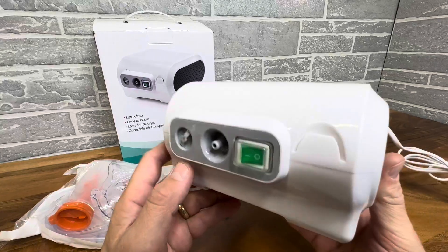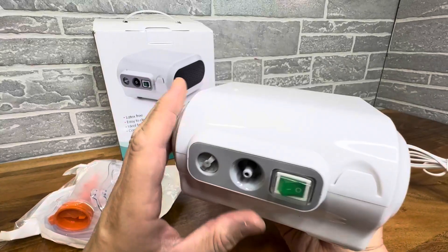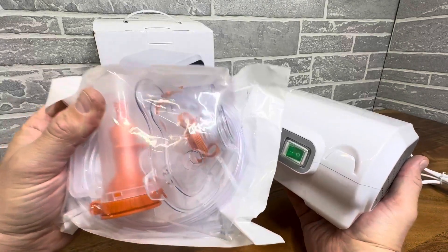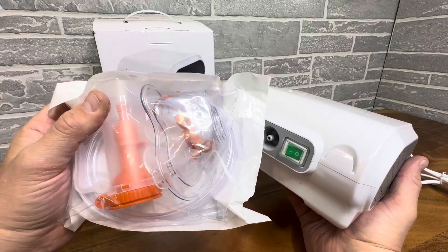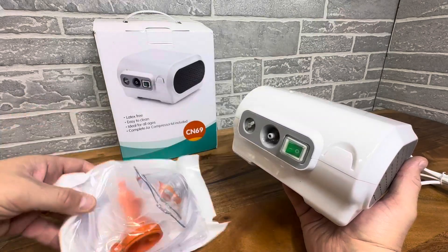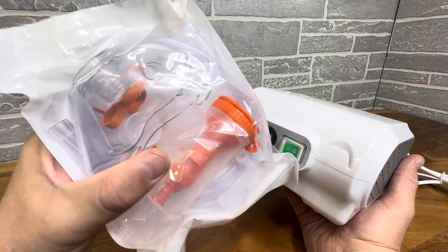Hey everyone, today we're taking a closer look at this nebulizer pump. This is a really nice standard nebulizer pump for anyone utilizing these for breathing treatments, depending on what condition you're dealing with or if you're just not feeling well. Whether you're a child or adult, it's going to work for you.